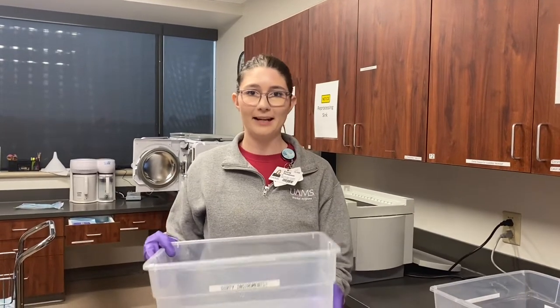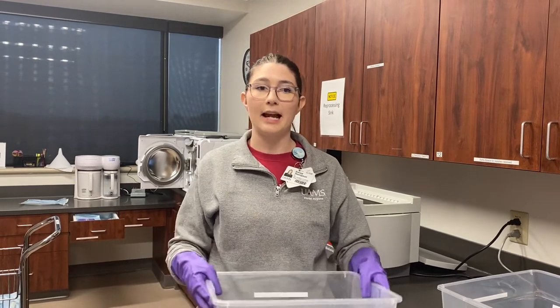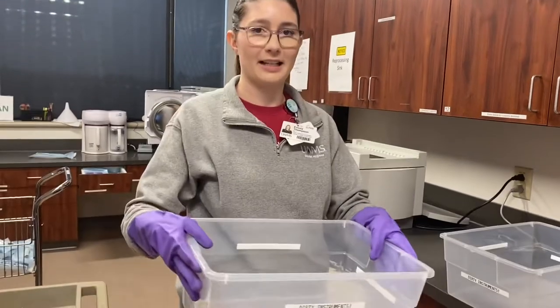Hi, this is Mrs. Thompson and today I'm going to go over the overall process of sterilization. As a CA you are required to wear these nice purple kitchen gloves and when you carry around this bucket to collect the instruments.